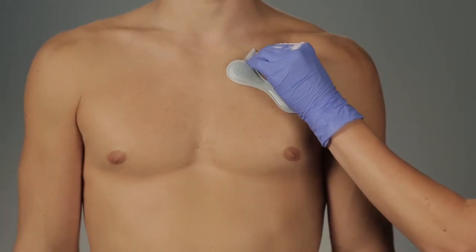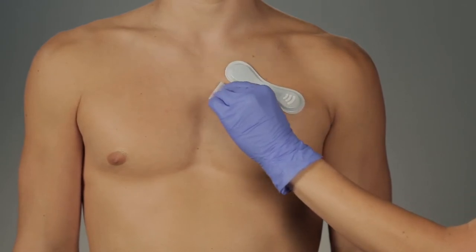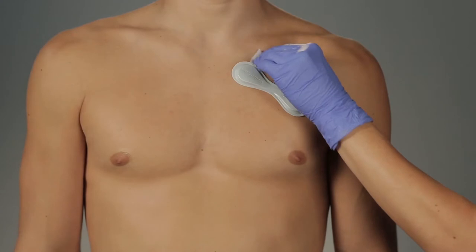Before applying the overlay, clean around the vital patch biosensor with an alcohol wipe and allow the area to dry. Remove any body hair to optimize adhesion of the overlay.